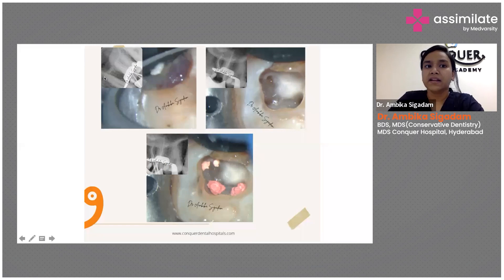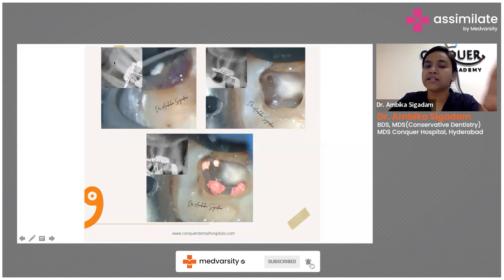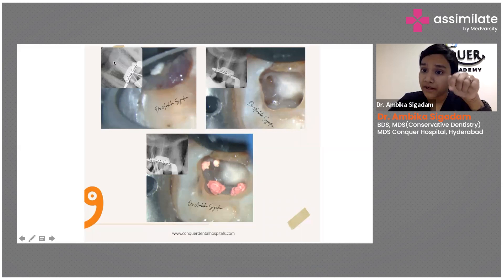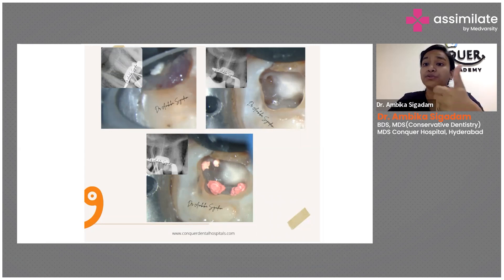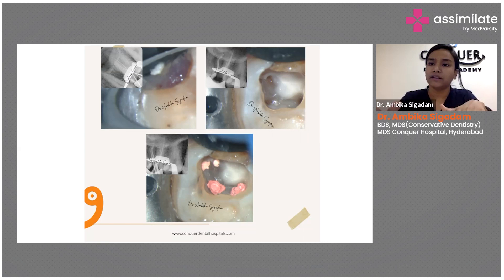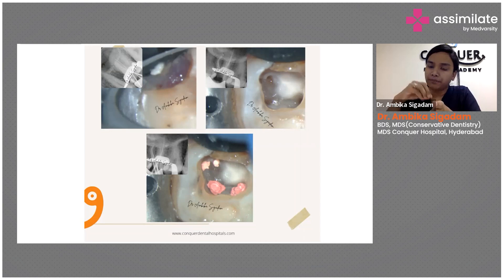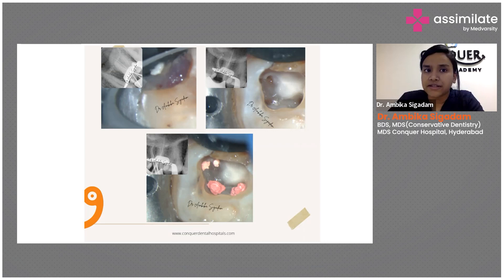In this case, if you see properly, there is a periodontal ligament widening. We open the tooth, give calcium hydroxide, and relieve the tooth from occlusion because the periodontal ligament has already been involved. This gives a time frame for the PDL to heal. There is just a single line of PDL widening visible here.